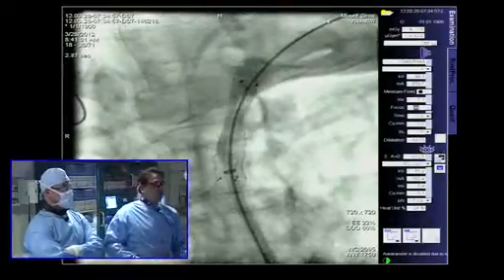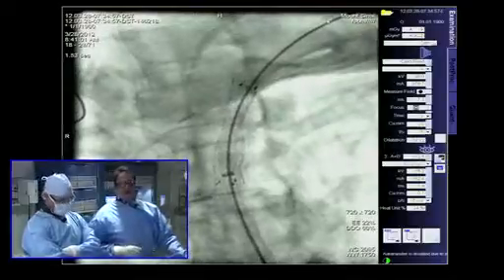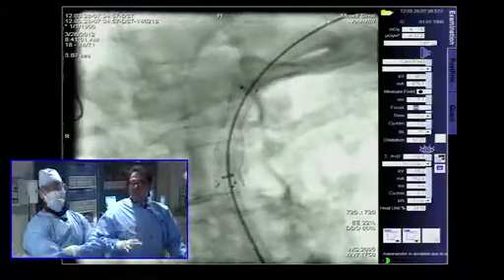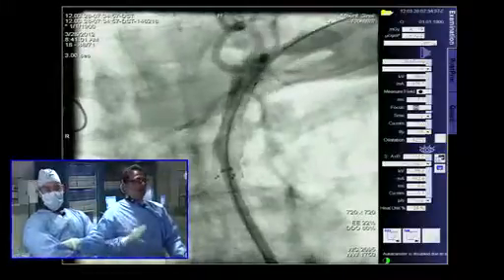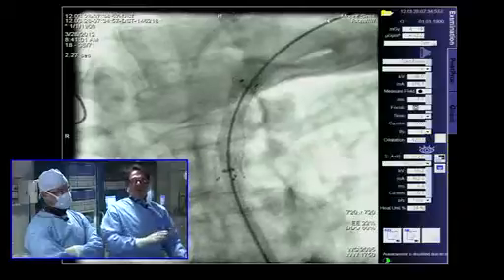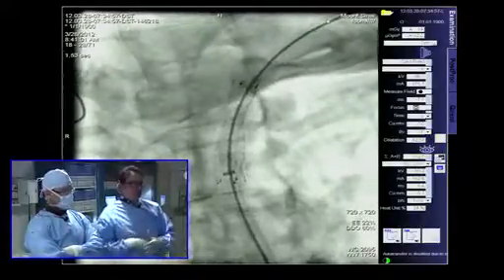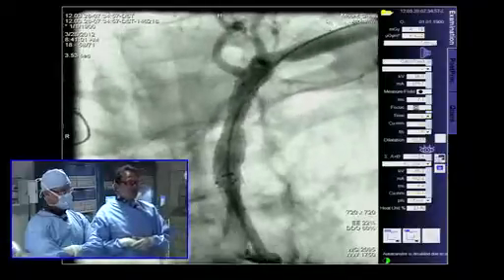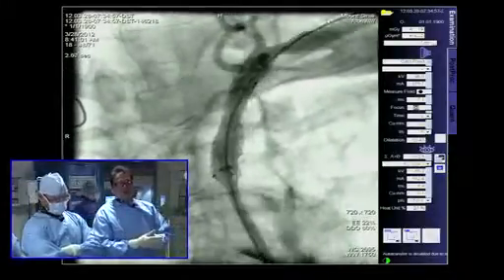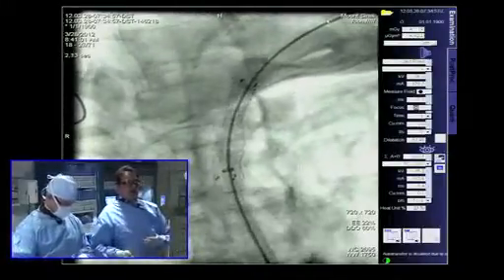One of the things that I want to stress to everybody is that unlike the coronaries, in the endovascular space we're treating gradients. We're treating pressure differences. So yes, you may have a stent that you would not accept in the coronaries because of this dent, and there's been no stent thrombosis data associated with this in the peripheral as far as I'm aware. So the bottom line here is I want to eliminate this gradient, which was 100 millimeters before, to now whatever it's going to be, and then we're going to make a decision.